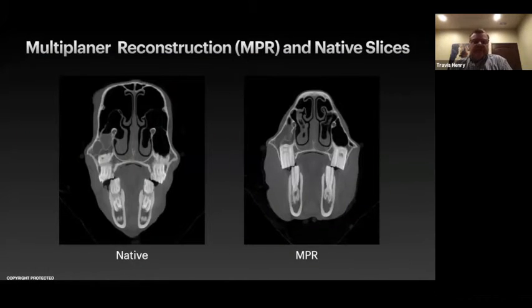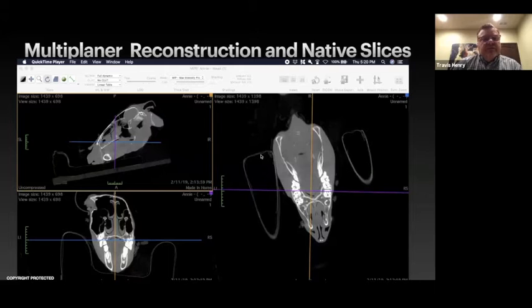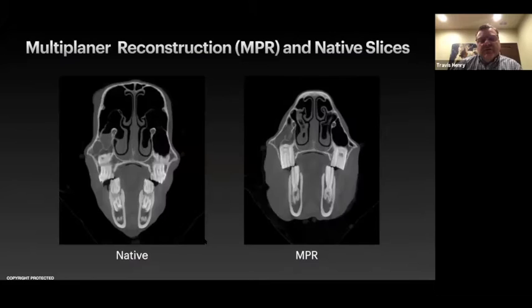The bottom line is that when the native image of this horse came in from the unit and you would just scroll through the native DICOMs, you could see that this is part of the occlusal surface of one tooth, and then we're picking up a little bit of the apex of the other. And that was just how the horse's head was in the CT unit. Because if we go back to this, if the head is angling down a bit and the CT is slicing them in this region, what you're going to do is clip off part of one tooth and part of the next.